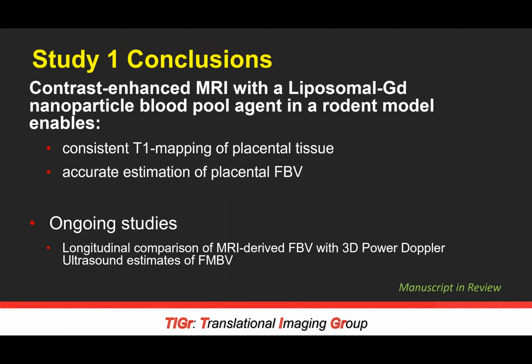So with that, I'd like to conclude and wrap up briefly this first study. Using contrast-enhanced MRI with this liposomal gadolinium nanoparticle agent in a rodent model, we were able to consistently map T1 values of placental tissue, both pre and post contrast, and enable estimation of placental FBV.